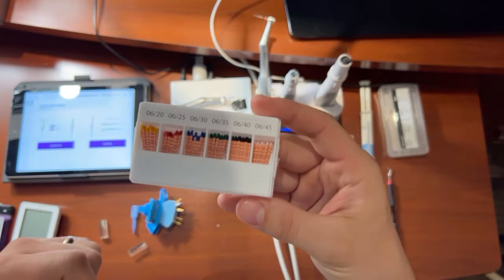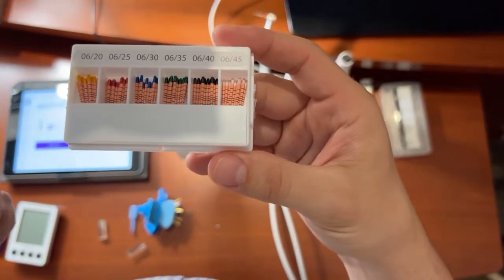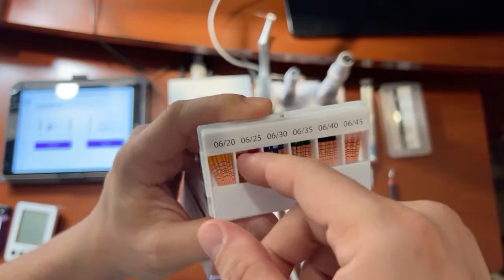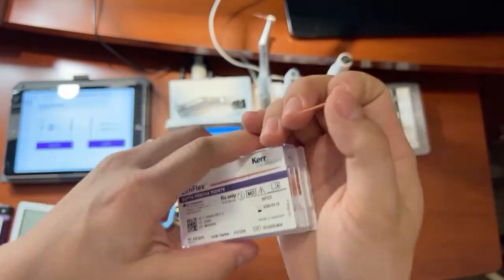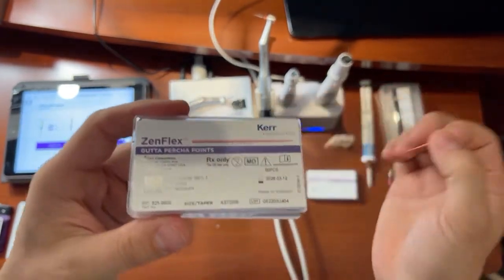But for this scenario, since we shaped to a 2506, we would just need to grab out our 2506 gutta percha cone.